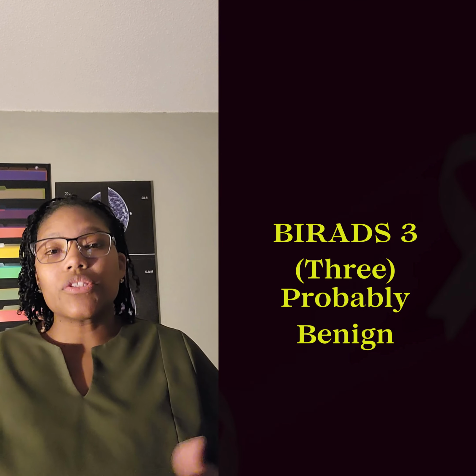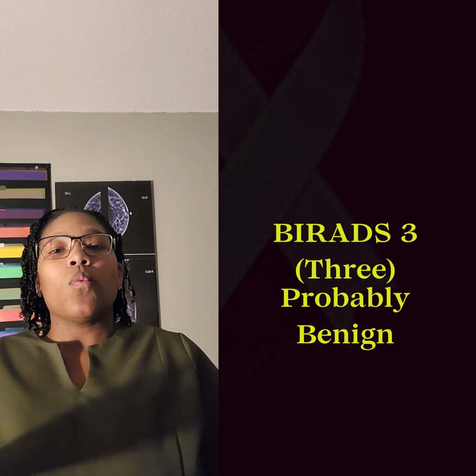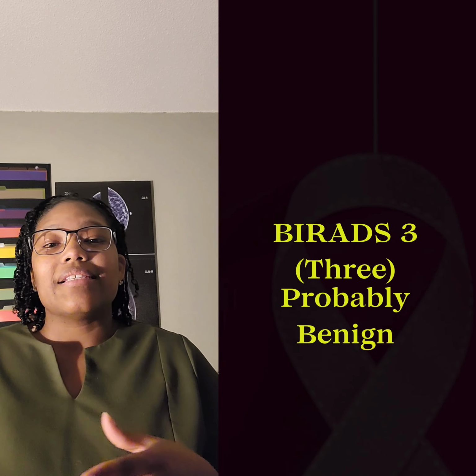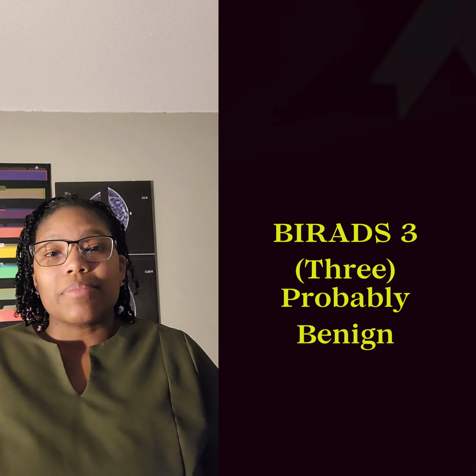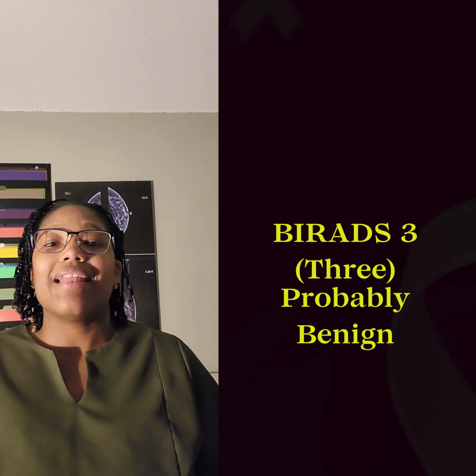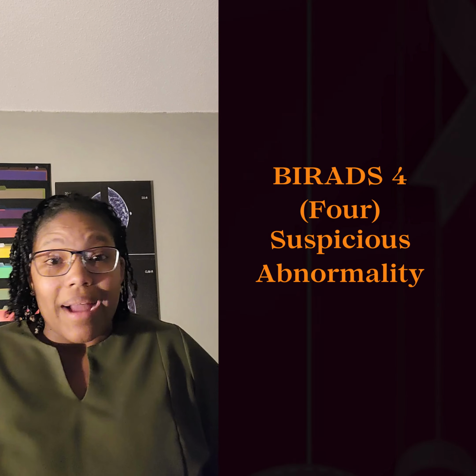BI-RADS 3 means that you went in for additional imaging, and the radiologist felt there is something that we need to follow, with a follow-up. Sometimes it's 6 months, sometimes 1 year, sometimes a 2-year follow-up plan, and that depends on the reading radiologist. A BI-RADS 4 means that you need a biopsy.